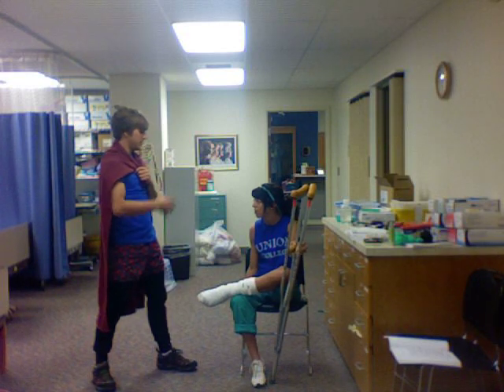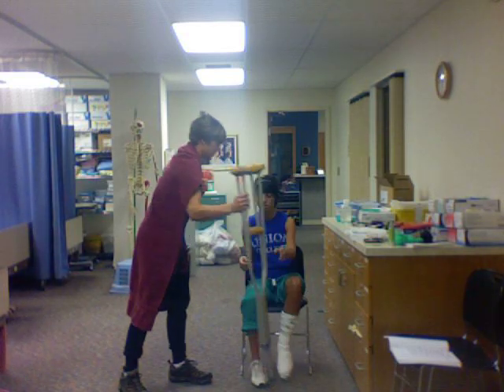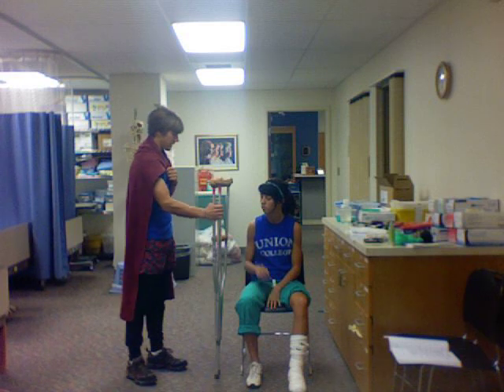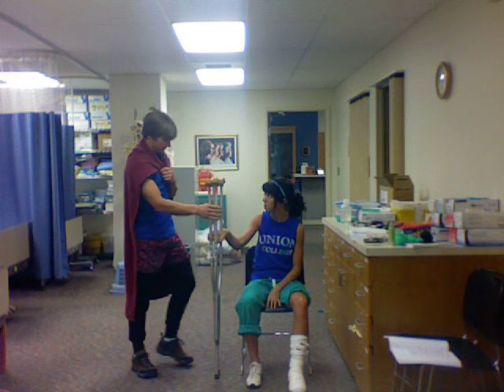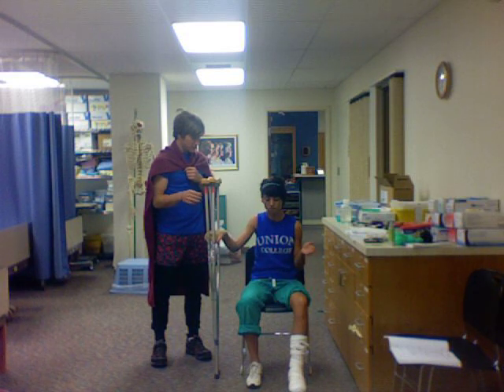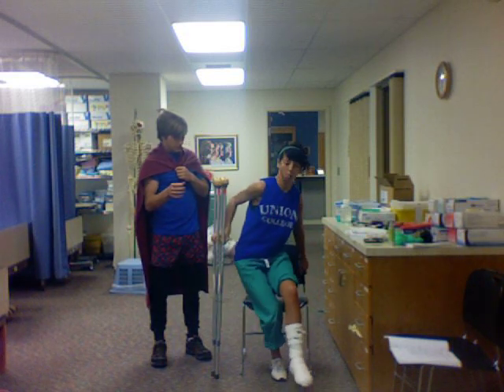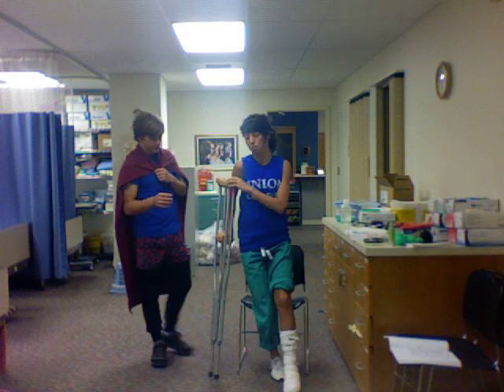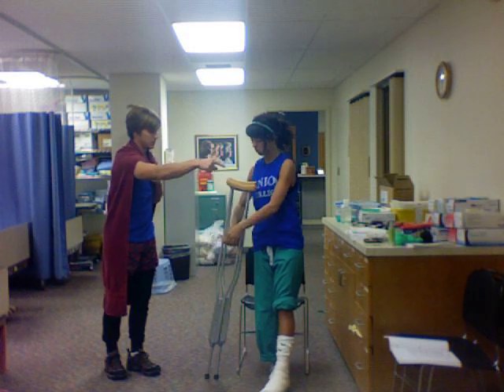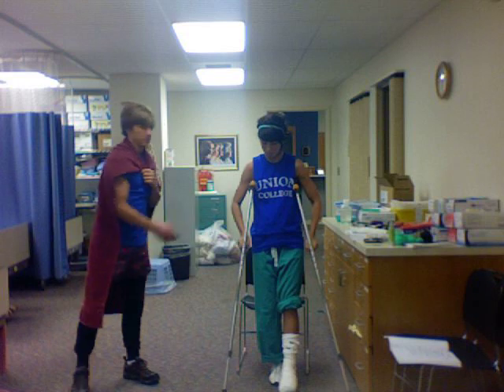Well, I, Crutch Man, am here to help you. First of all, we need to take the crutches and learn how to get up with them. To do this, you will take the crutches in your right hand — both of them. And then you will take your left hand, use the chair, and push against the chair, standing up and putting all the weight on your unaffected foot. Now you will take the crutches and put them on your sides, right underneath the armpits.